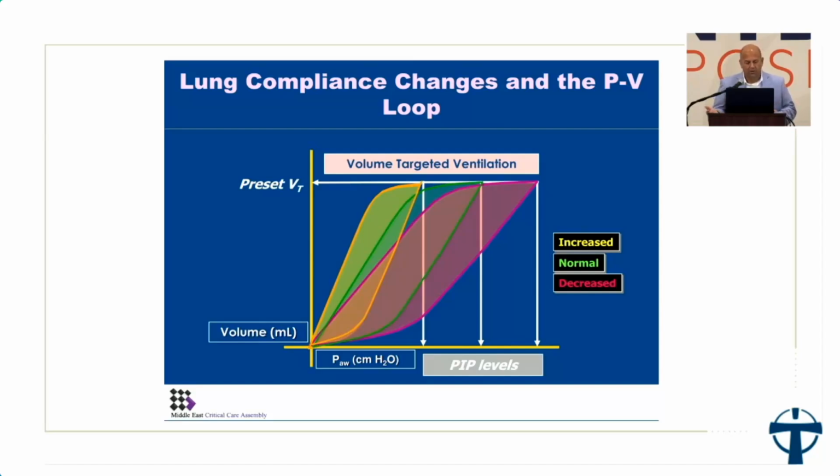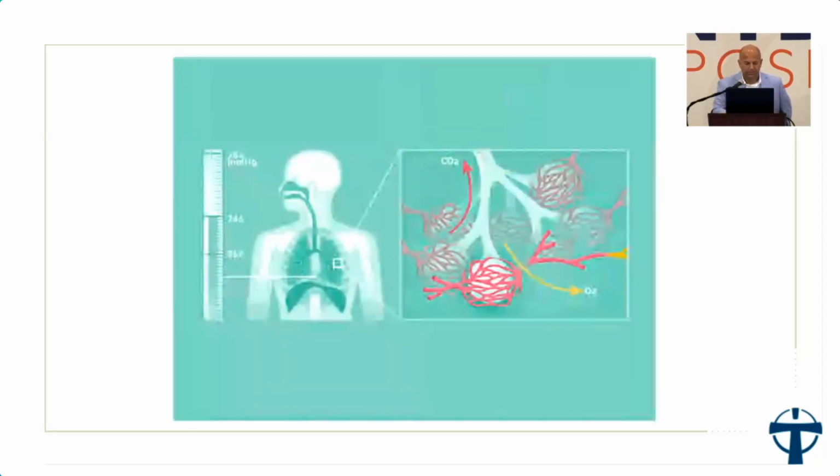I often use this when we're trying to wean from ECMO and ask if we're ready to come off. I'll open up the compliance on the ventilator, and it's shifted to the right and hasn't moved in the last 3 days. So guess what? We're not ready to come off. We're not ready to do anything with this patient.